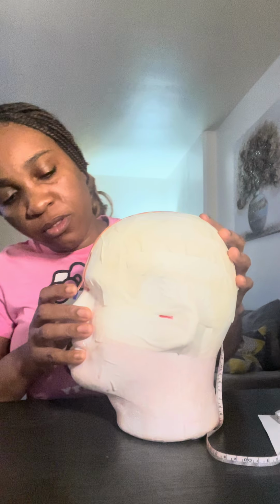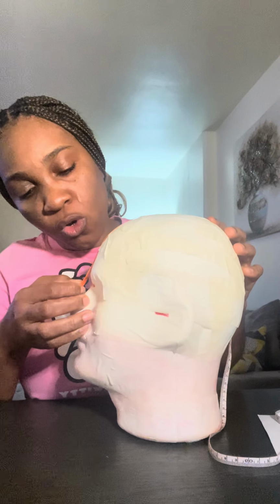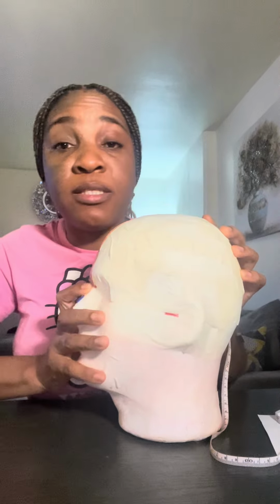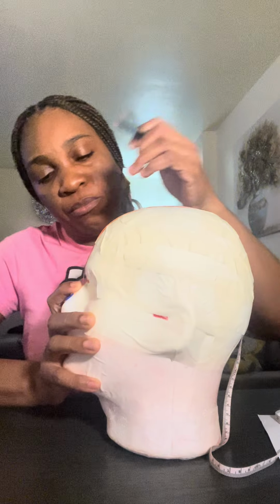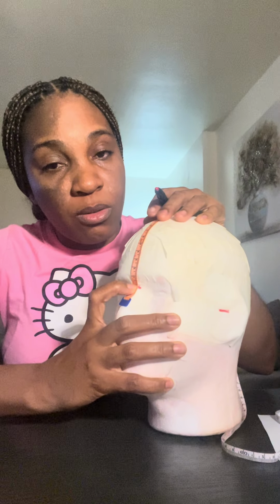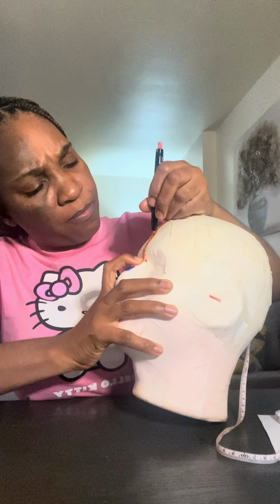So half of the 35, you can take half of the 35, or you can start with your 10-20 measurement by taking 10% of the total mark. So I'm going to take the 10% of the total mark, which is 3.5. Putting my 0 mark on the Nasion, going back 10%, which is 3.5.